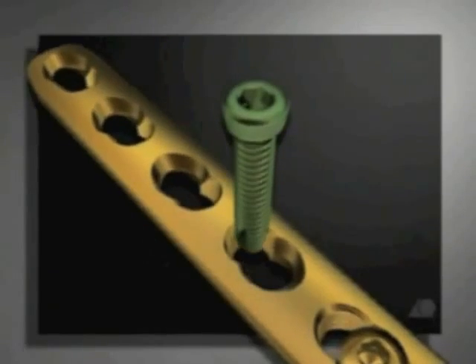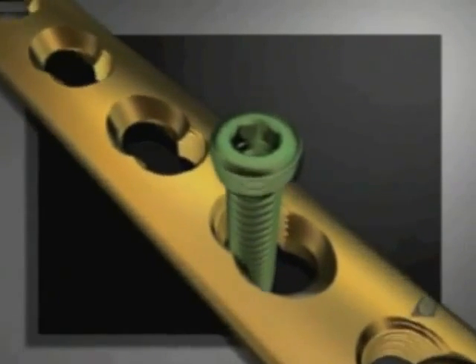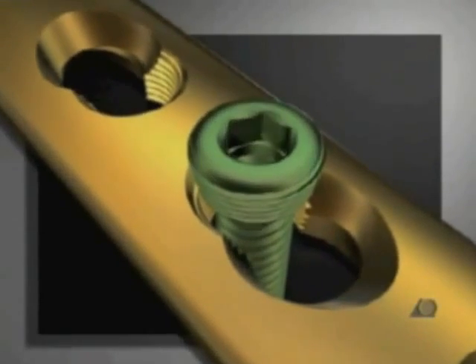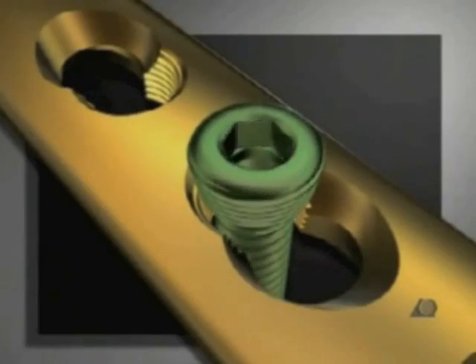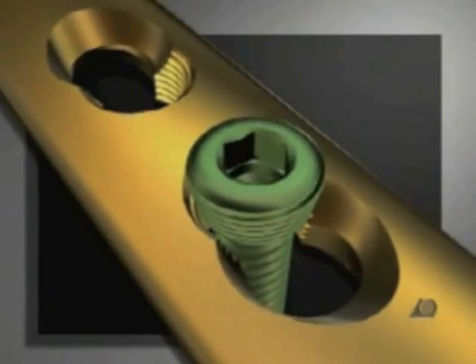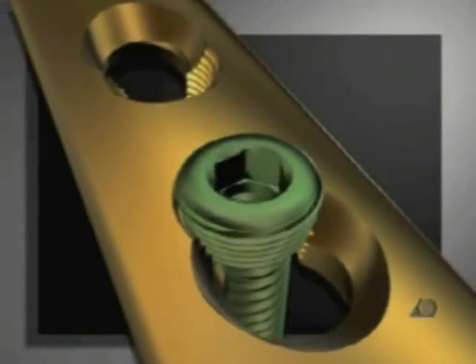The locking head screw is inserted in the threaded part of the combination hole. The head itself will lock firmly in the plate when driven home, thus providing angular as well as axial stability.